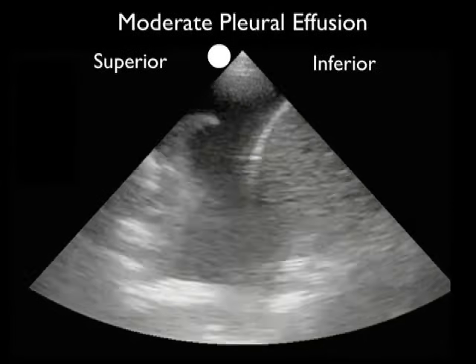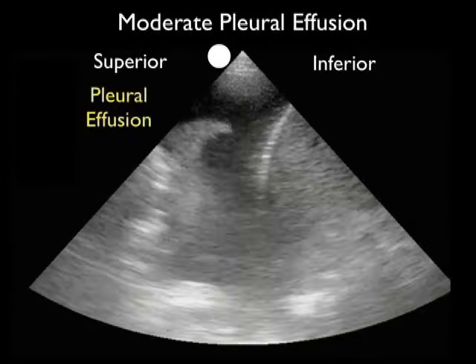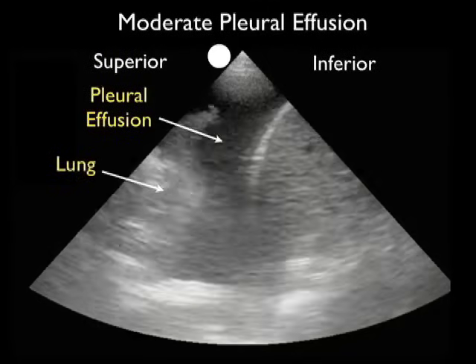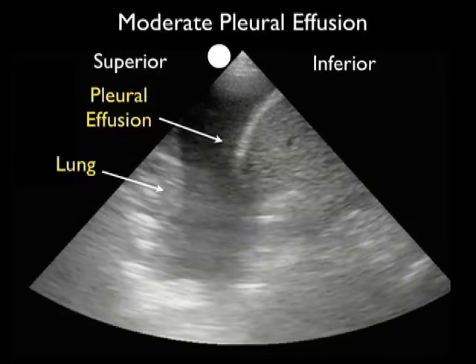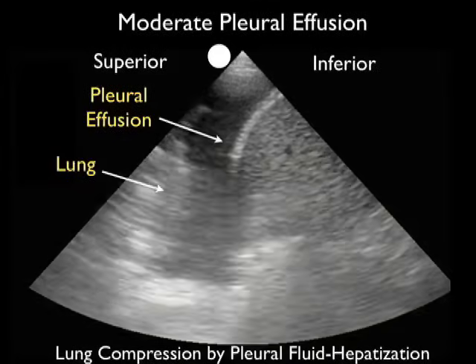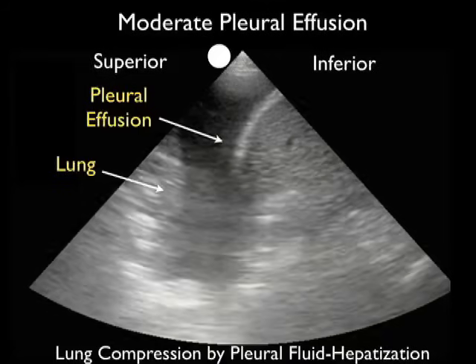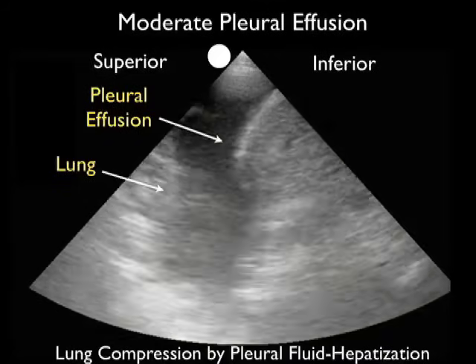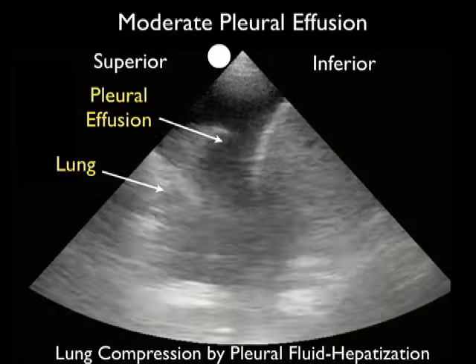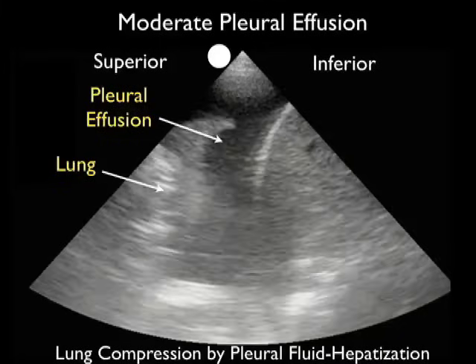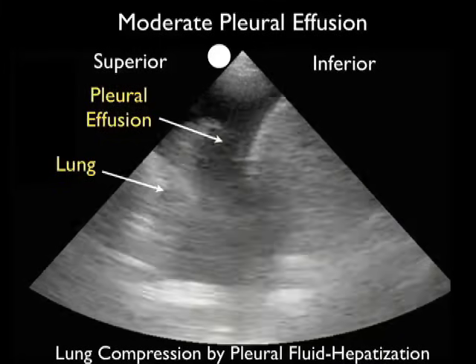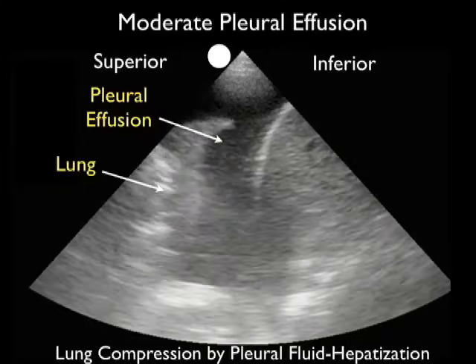Here's a moderate pleural effusion as taken from the right upper quadrant view. We see the liver to the inferior aspect, the curving white line of the diaphragm in the middle of the image, and fluid representing a pleural effusion superior to the diaphragm. Interestingly, we see the lung moving around, compressed down by the fluid within the chest cavity, taking on what appears like a liver within the chest — something called hepatization of the lung. This is commonly seen with a pleural effusion as it pushes in on the lung, making it more of a solid-type organ.